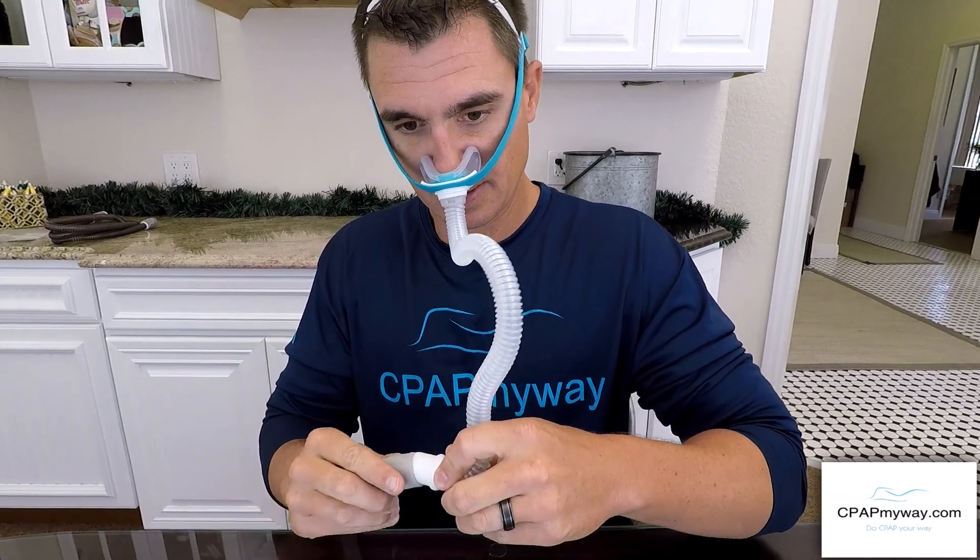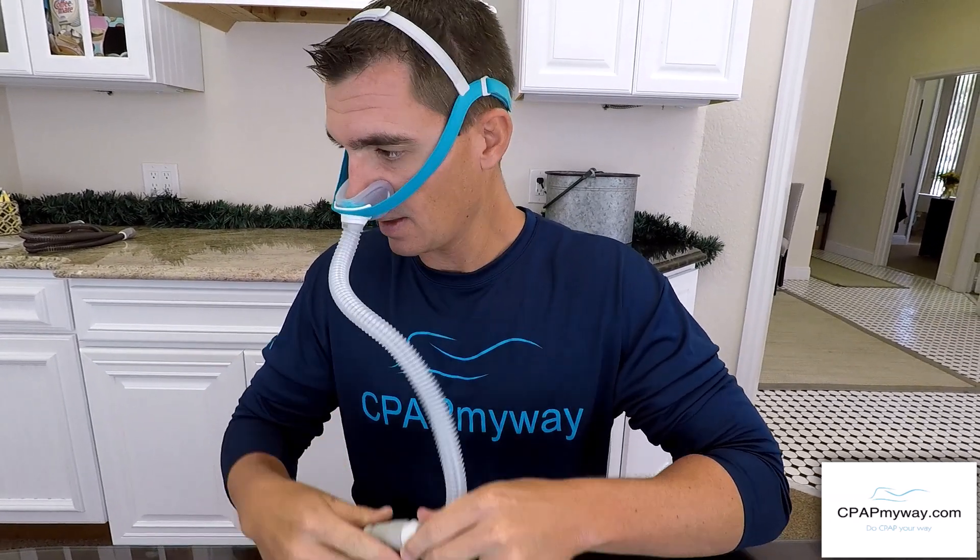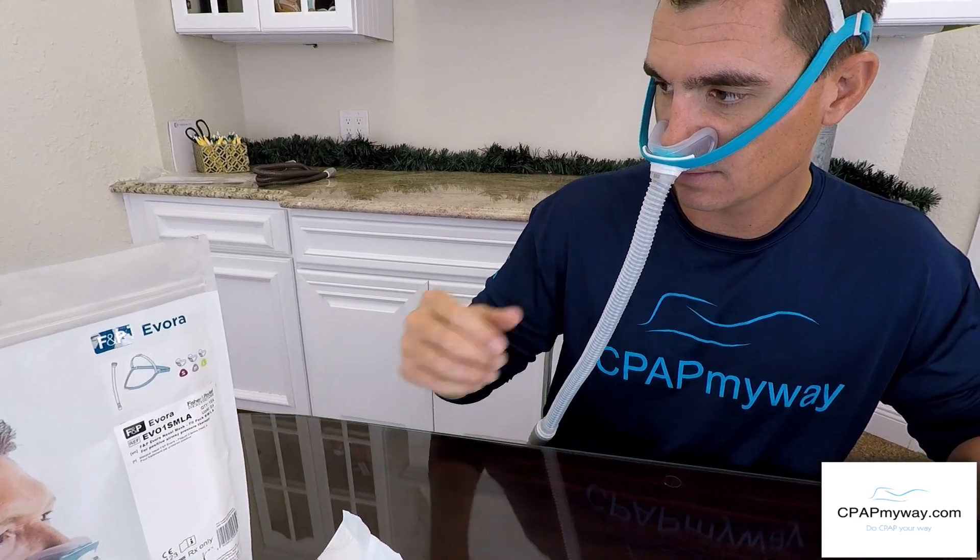We're going to turn it on here so you can get an idea of what it sounds like. The mask is running right now — it's super quiet. Exhalation is diffused around the front through little micro holes, and with my hand two inches away I can barely feel any exhalation at all. So it's wonderful for bed partners who have had too much exhalation sprayed on them throughout the night.